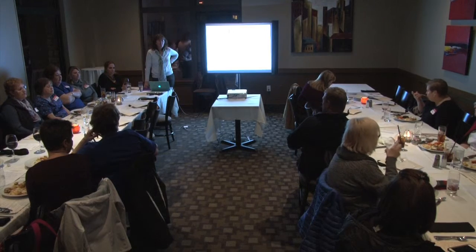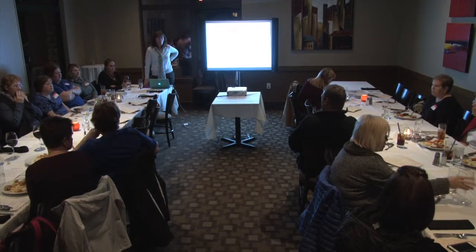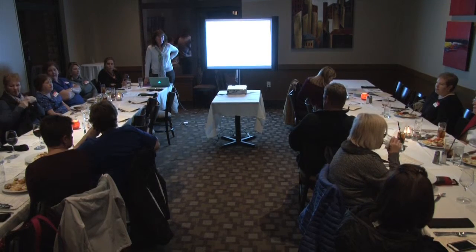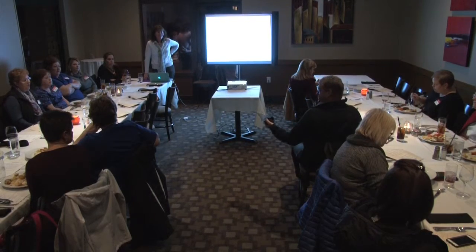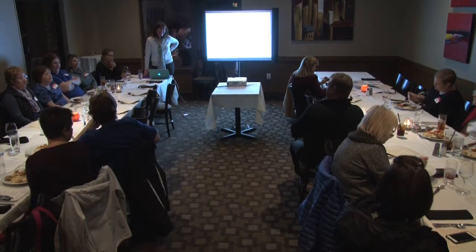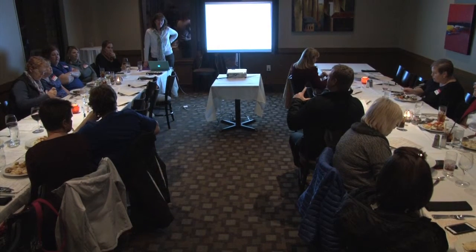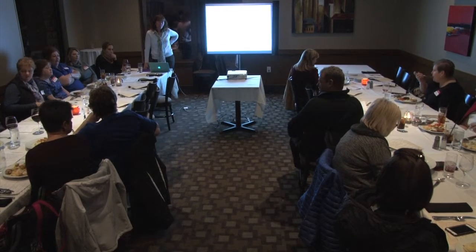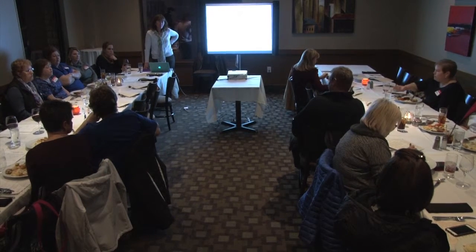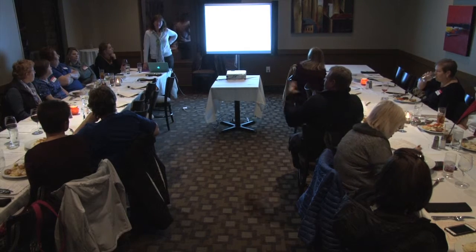But we're taught that we need to size our catheter to our vessel. So you put the ultrasound on their arm, and they got nothing. You can't see anything. You turn the tourniquet on, and then pow! You get this huge giant basilic that pops up. So I'm just throwing that out there for the clinicians that may have wondered that themselves. I mean, what do you do?